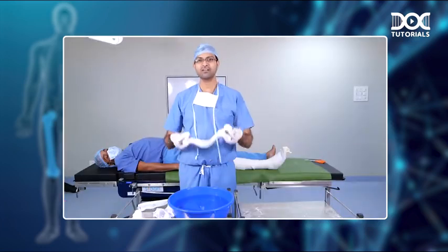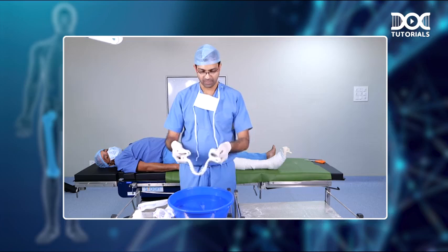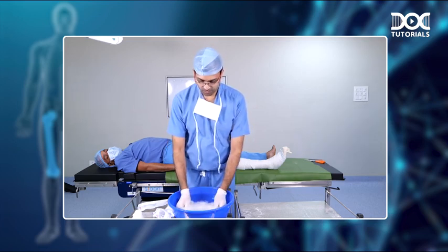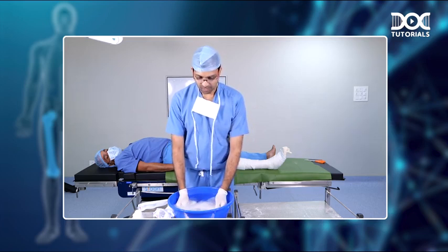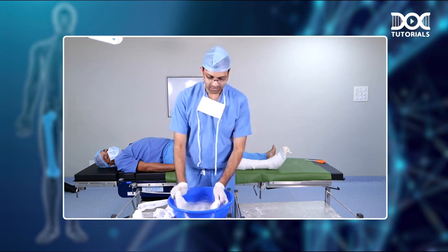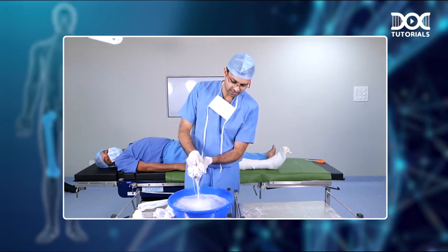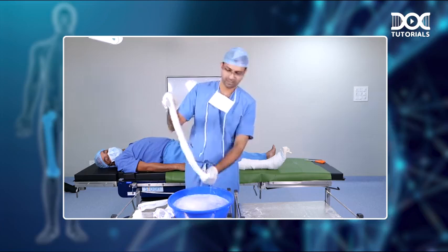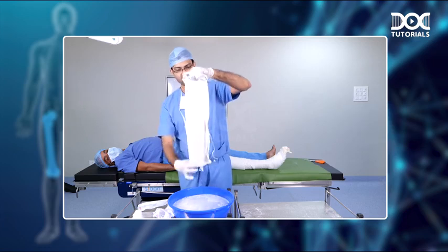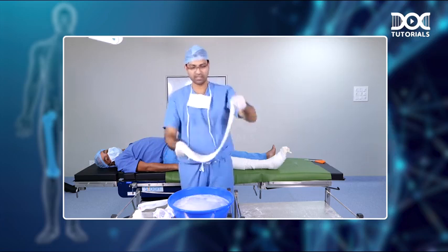Next step is dunking your POP slab that you have already prepared into water. So you dunk it fully inside water and wait for around 10 to 15 seconds till the whole slab gets soaked with water. Then you take it out and squeeze out the excess water like this. Then you straighten your slab with your fingers, make it into the beautiful rectangle shape that you need.